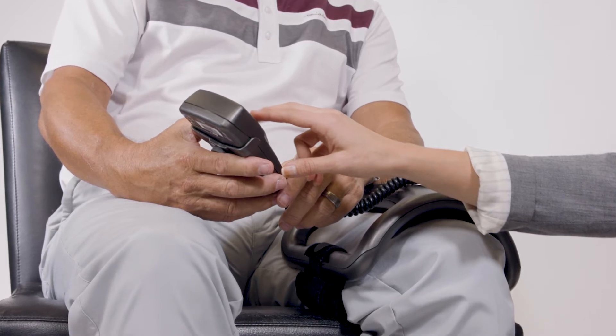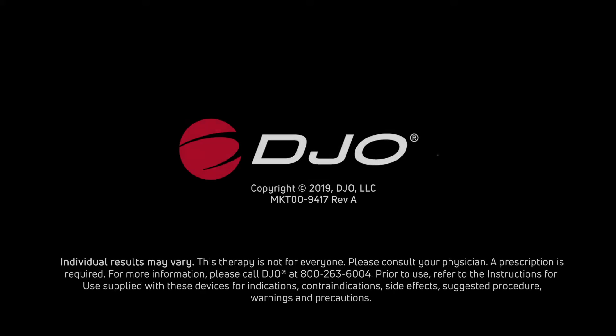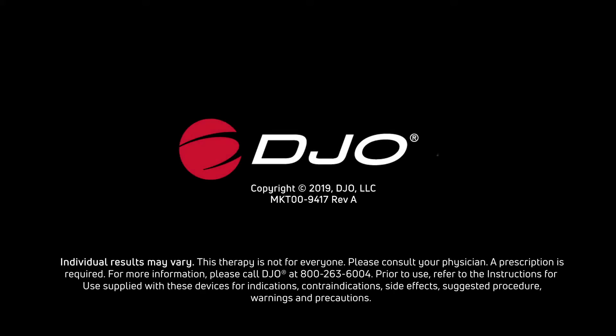You are now ready to operate your device. Individual results may vary. This therapy is not for everyone. Please consult your physician. A prescription is required. For more information, please call DJO at 800-263-6004.